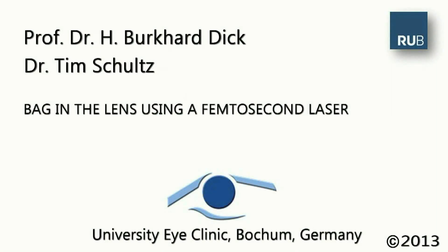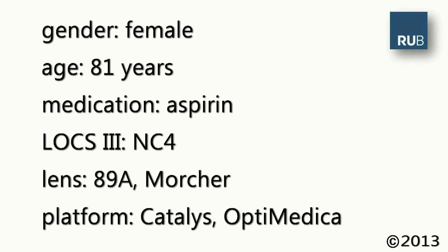We perform a bag-in-the-lens procedure using a femtosecond laser at the University Eye Clinic in Bochum, Germany. The patient is an 81-year-old female on aspirin with a grade 4 nuclear cataract. A Morcher 89A lens is planned.